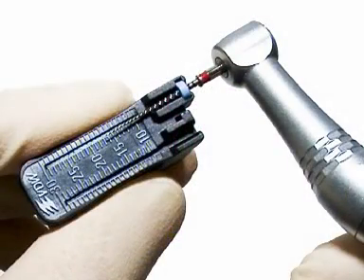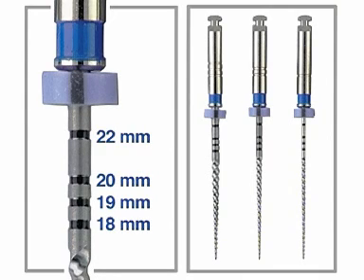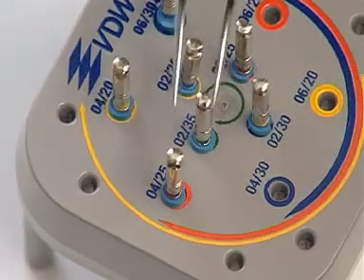The exact working length is set with silicone stoppers on all FlexMaster files. The depth ring markings on the instrument itself can also be used for reference. They are at 18, 19, 20, and 22 millimeter. The last file in the red sequence is the 0425.